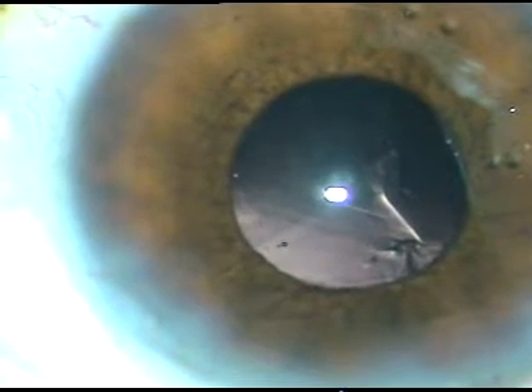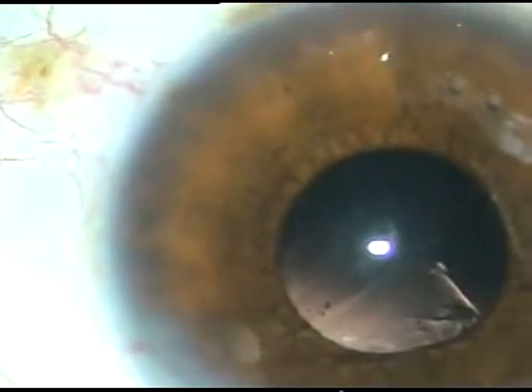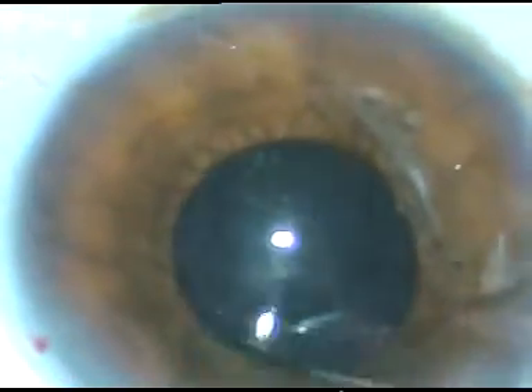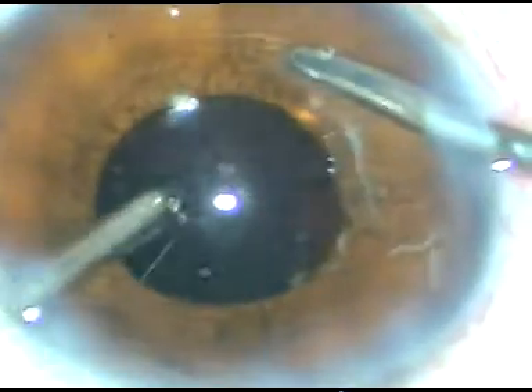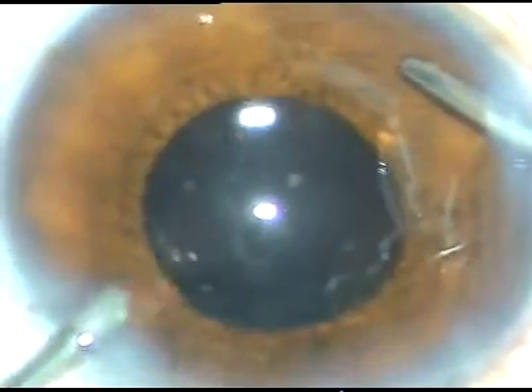That's it — this is how we can manage a case when the pupil becomes small while chopping or emulsifying. In this case, a hydrophobic acrylic aspheric intraocular lens has been implanted into the capsular bag. This lens is from AMO — Abbott Medical Optics. No financial interest, but glistening is very minimal. My observation is that glistening with AMO lenses is negligible — it remains very clear.